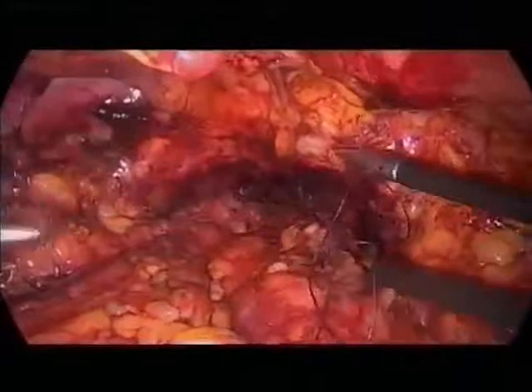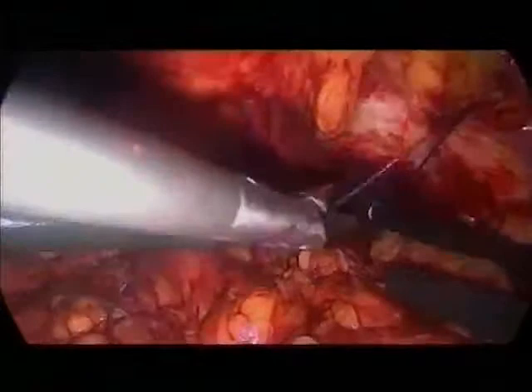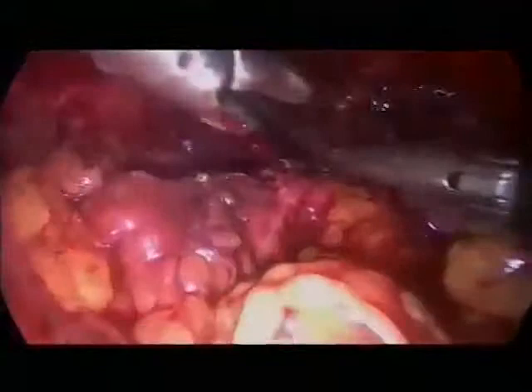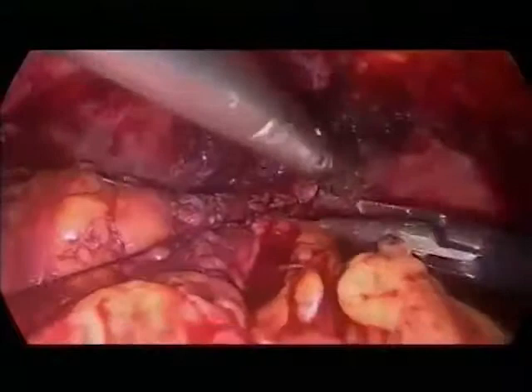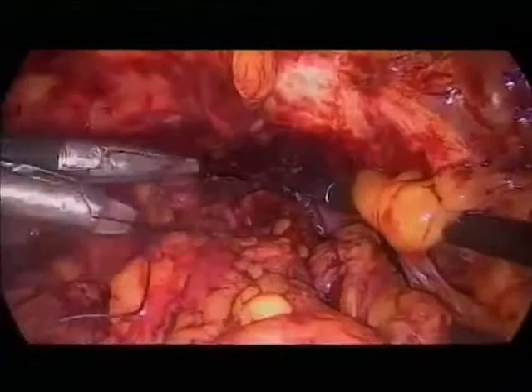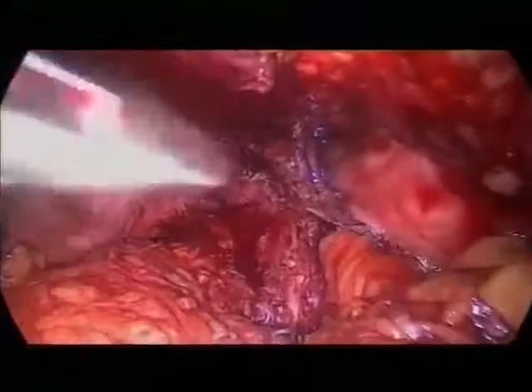Okay, we go back to Jens-Uwe for just a moment, and then come back to you, because he has almost finished the anastomosis. Yeah, so we are performing now the 4 o'clock stitch, and we have removed the old catheter that we inserted at the beginning, and we change now to the silicone catheter. There's always a risk to injure a little bit the catheter with the stitch. For this reason, we change to a silicone one. In my hospital, we leave the catheter for 5 or 6 days, and then we remove. And very, very rarely, under 1%, we have problems with a leak. So this is the lumen now.